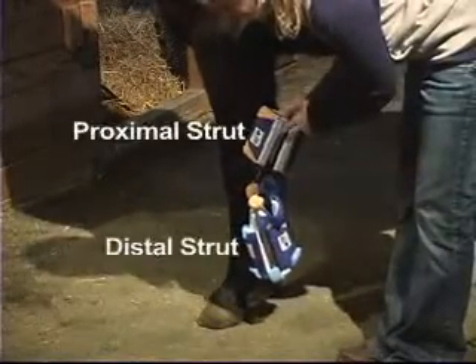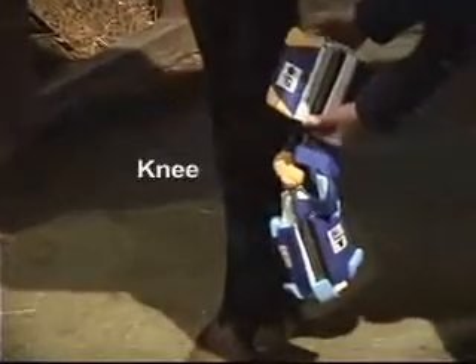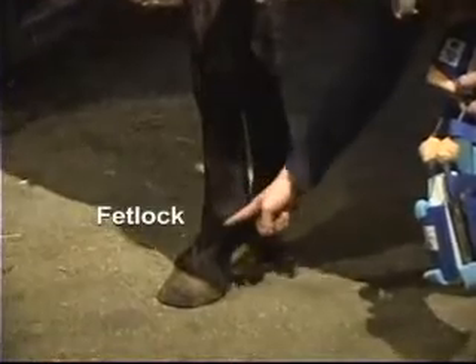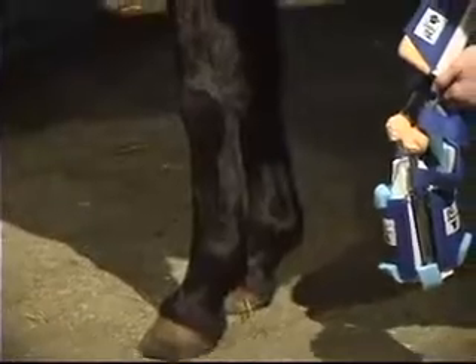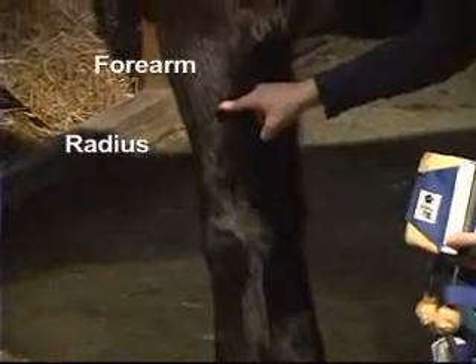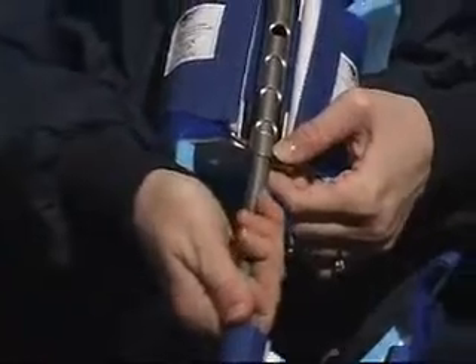Hold the Dynasplint System up to the horse's leg to check the length of the proximal and distal struts. The cam wrapped with padding should be lined up with the middle of the knee. The distal struts should extend as far down the cannon bone without coming into direct contact with the fetlock. It can lie close as long as the padding and the strut itself are not rubbing or causing irritation. The proximal struts will extend as far up the radius and should fall right below the large muscle on the forearm. To adjust the length of the struts, you will find set screws covered with electrical tape or a pull pin and lock adjustment on the proximal and distal struts.